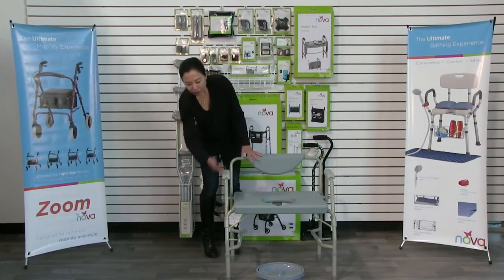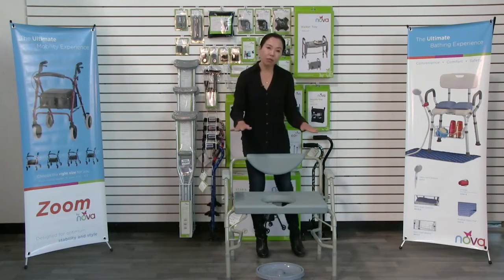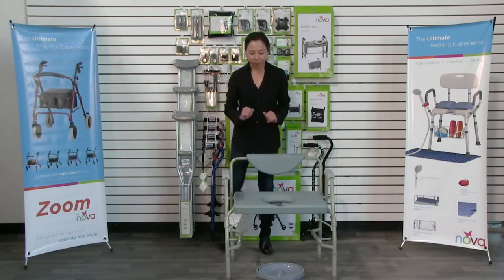You'll notice the legs are adjustable, so you can adjust the height of the commode seat. You just want to make sure that all four legs are at the same adjustment.